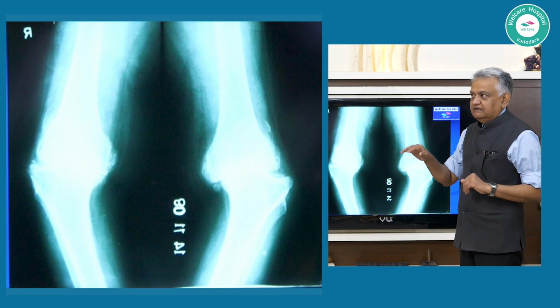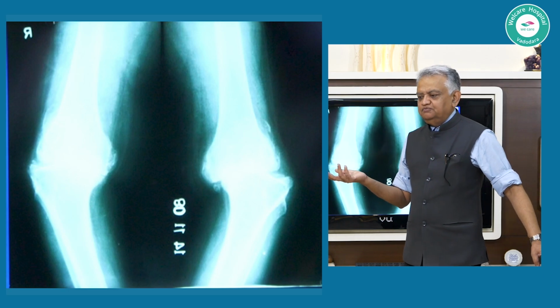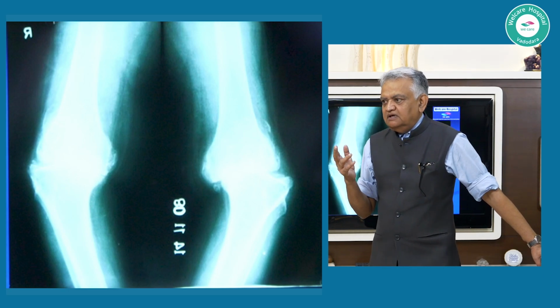But again, we have already gone through all this: either you be a very purist and try to assess the preoperative slope if you can, which I doubt, because in a bilaterally advanced knee like this, how do you know what the original posterior slope was? So at our place here, we stabilize at around 3 degrees, 4 degrees posterior slope.